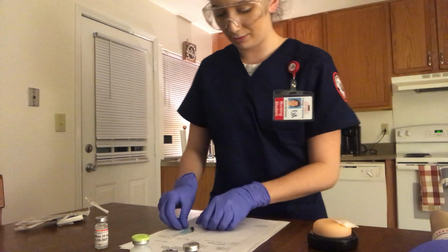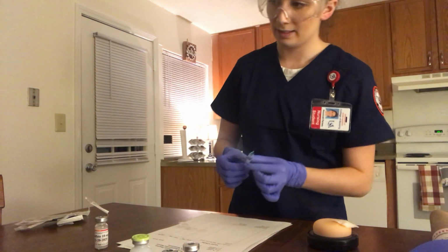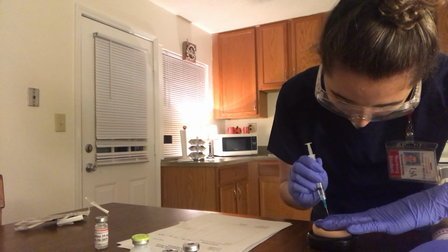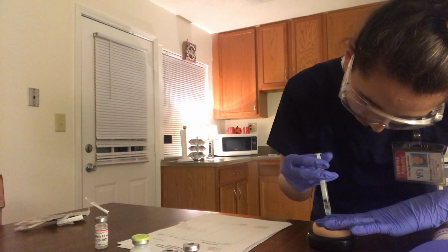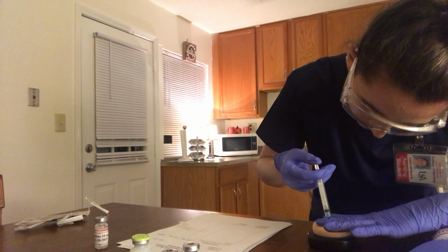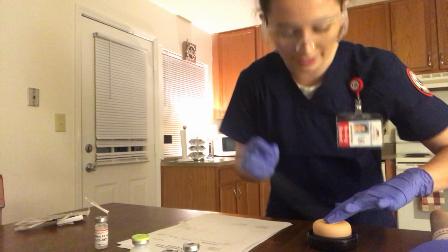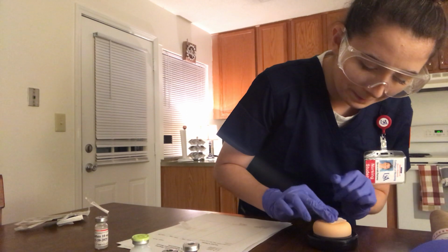After doing that, I will grab my needle, remove the cap, and dispose of it in the sharps container. I will pull the skin so it is tight, and I will inject the patient. I will pull back and aspirate for the blood, and then slowly inject the patient. I will pull the needle out and apply slight pressure, and dispose of my needle in the sharps container. I will not massage my patient. I will just put slight pressure.